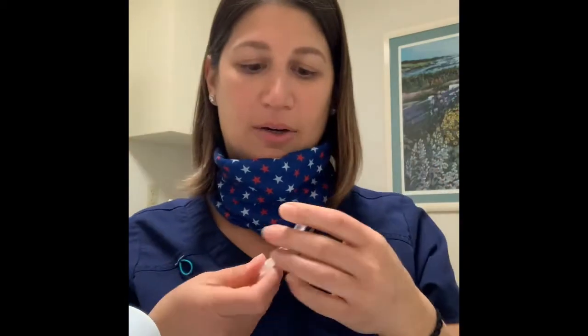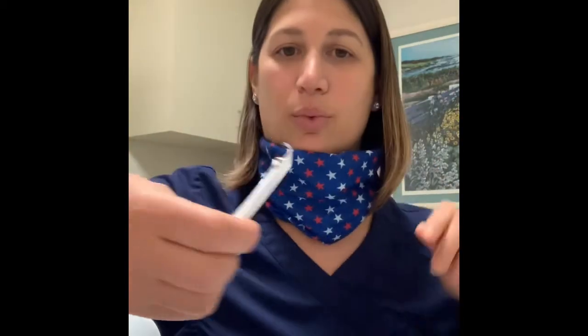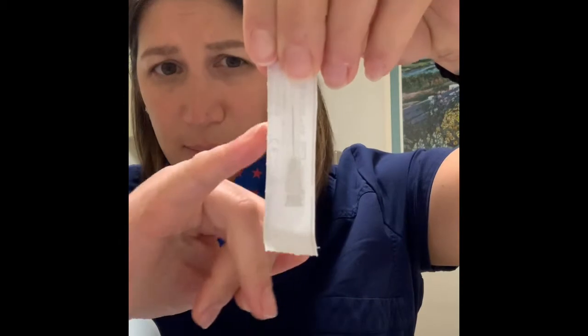Then there's another needle with a gray hub. This one is a little bit longer than your Menopur needles, so if you would like to, you can use a Menopur needle instead of this one because it's a little bit longer.